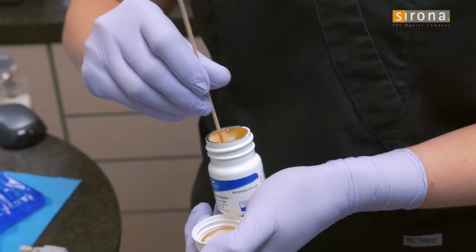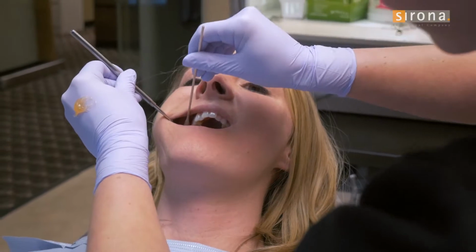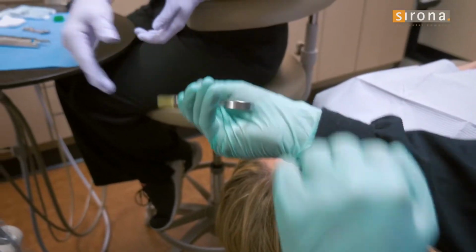And so really the first step is going to be the dental assistant placing the topical anesthetic. And typically this is a time where someone will go get the doctor and we're letting the topical soak in so that we have it in the mouth for 60 to 90 seconds, and then the doctor enters the room and gives the local anesthetic.